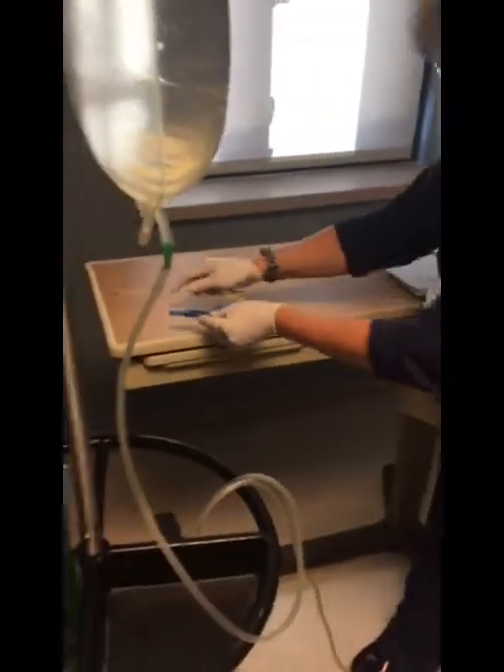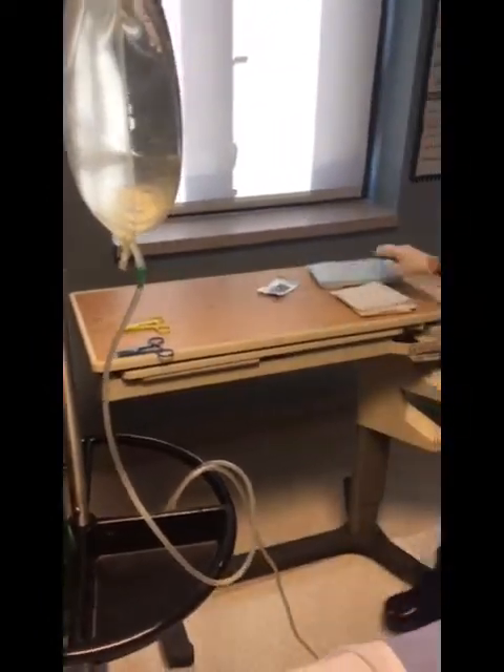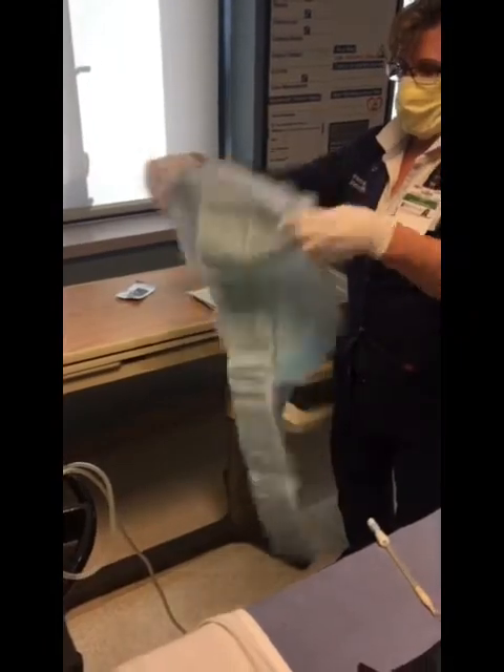You'll put a chuck on the floor for your drain bag to go on. Get your supplies all set. You need two clamps — have those ready. Take another chuck and place that under the patient.